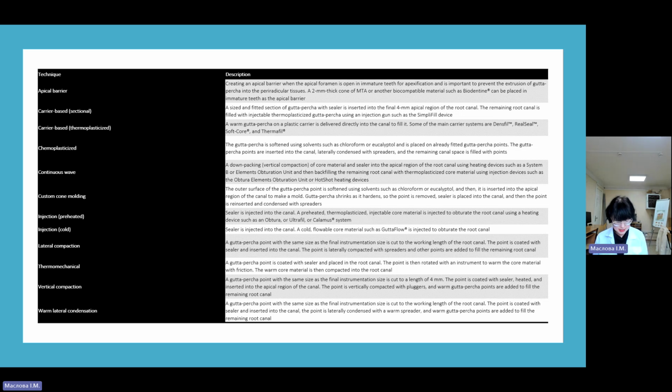The type 3 HCSC sealers demonstrate sound physical properties. It consists of a yellow colored base paste and a white catalyst paste. It is indicated for use in cold and warm root canal filling techniques. It has a high pH and therefore displays antimicrobial activity.